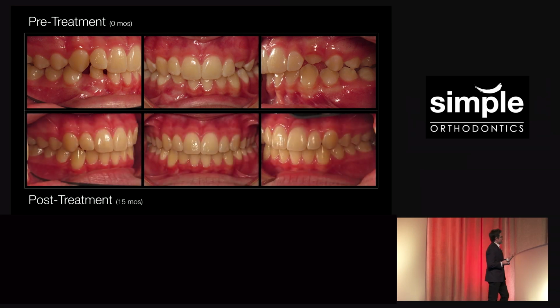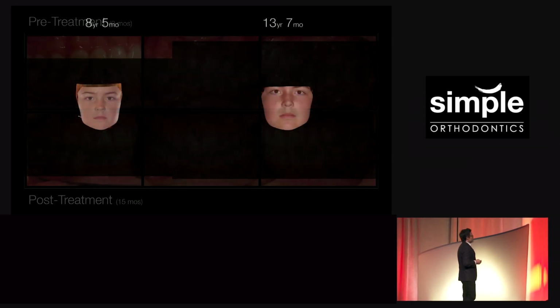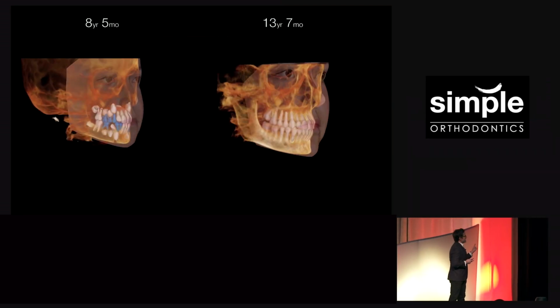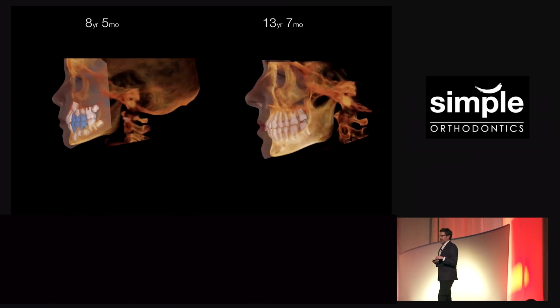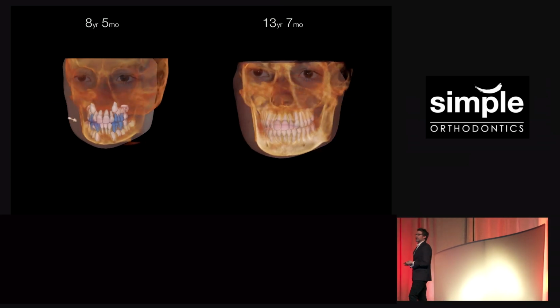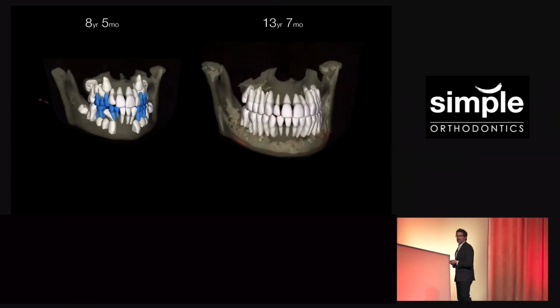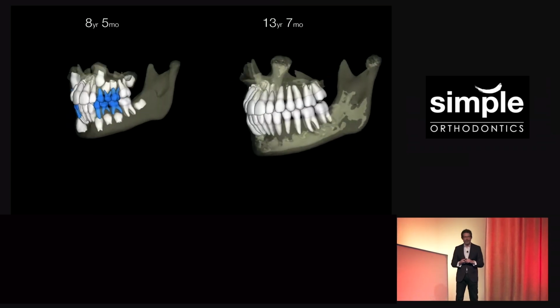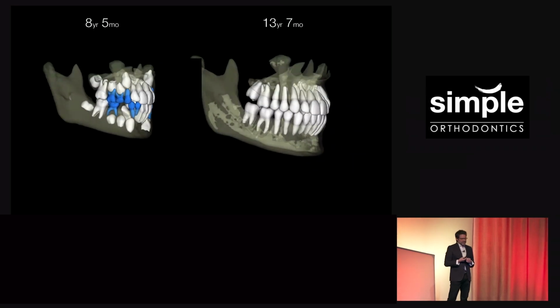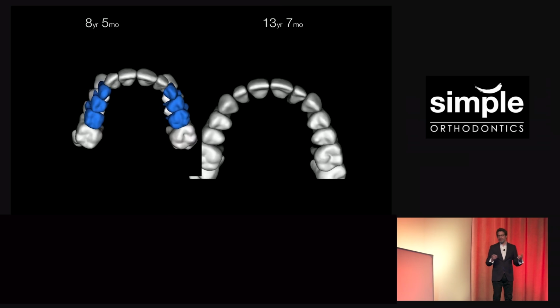We were able to take her from a pretty crazy transposition, with a little bit of nudging of Mother Nature, to a place where now we have really nice root alignment. And if someone just showed me the picture on your right and told me that lower right lateral and canine were almost transposed, I would say, no, I don't believe it, because I'd like to see more of a trace of the crime, or you normally would. The earlier you catch these things, the better they resolve.